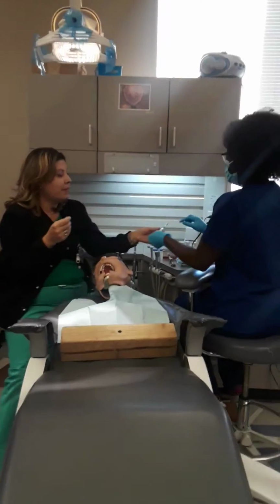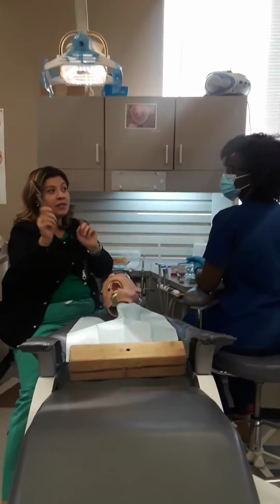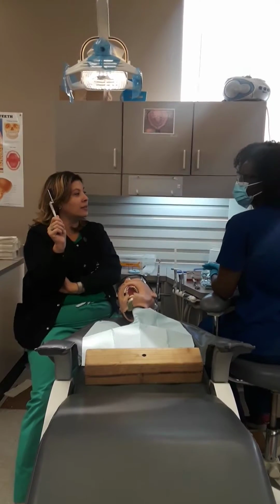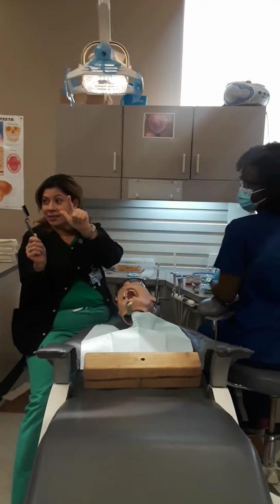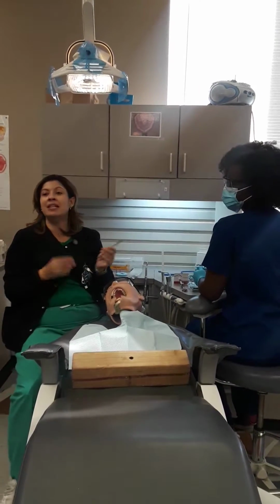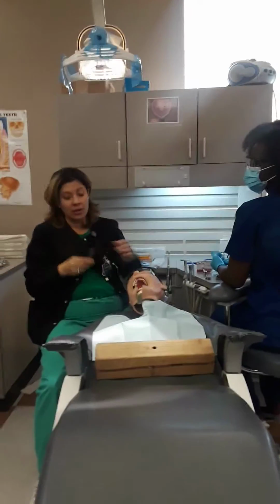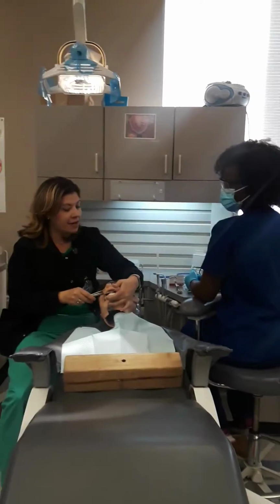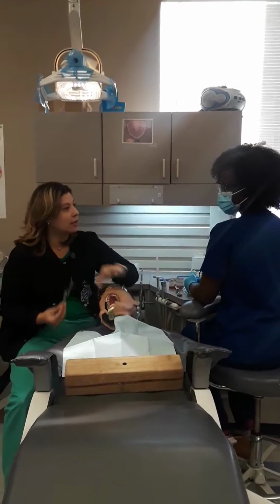Okay, articulating paper. We talked yesterday about our bite, so we have to make sure we get our bite. What surfaces do we check if we need this instrument? What surfaces do we need to work on? Occlusal, incisal, lingual, especially for upper anterior, because when your patient bites, the lower teeth hit the lingual. So if we're working on the lingual side of that tooth, we have to check the bite, make sure that's even, or the occlusals, and then our incisal edge for upper and lower.